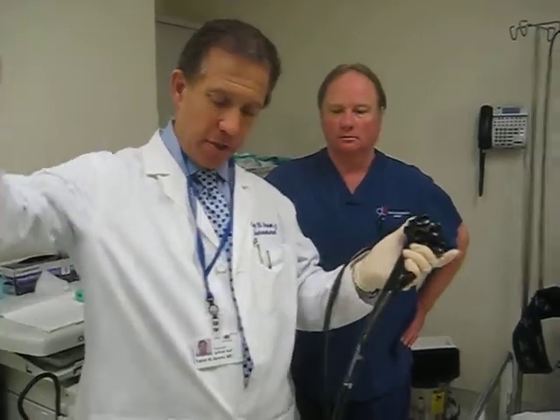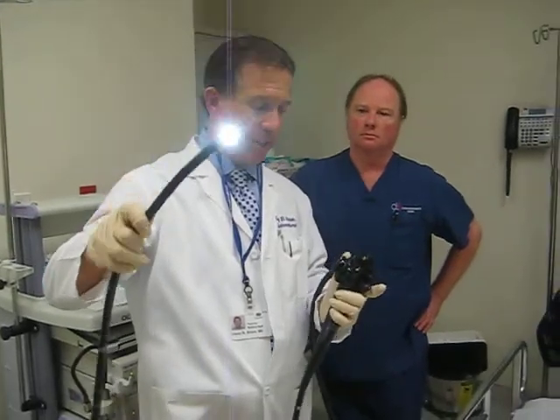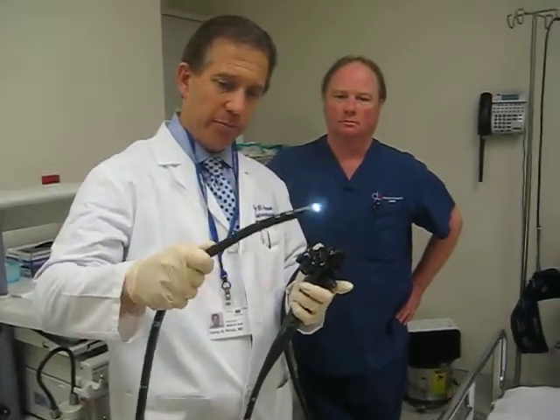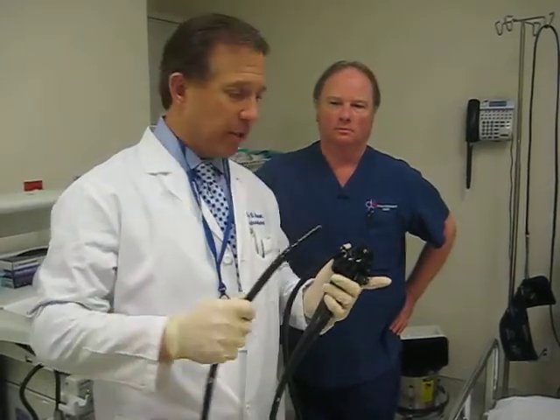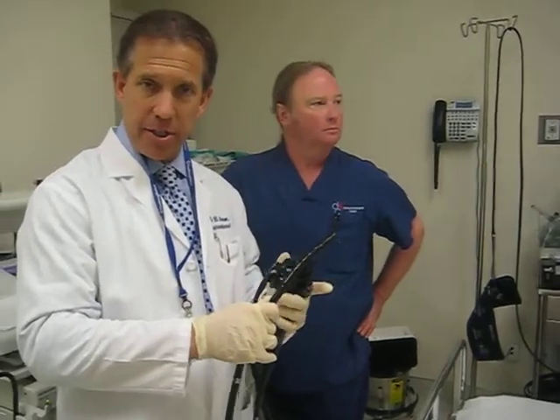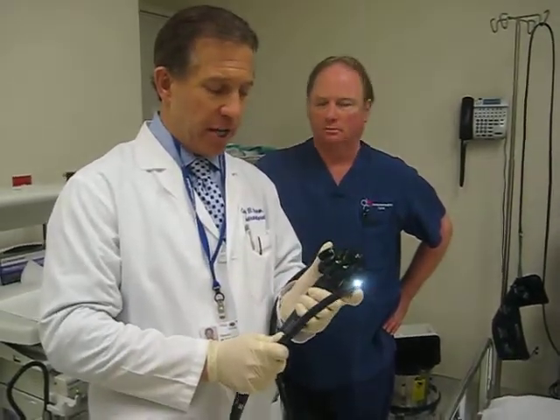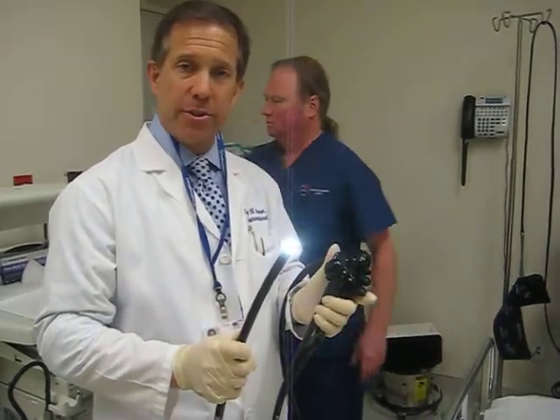So this is a colonoscope. It's long, it's flexible, it's got the light on the end of it. This is what we put into the colon. The procedure takes about 10 minutes. You don't feel anything at all because you are sedated. I normally do this with my tech Bob and the anesthesiologist. It's very, very safe and can absolutely prevent colon cancer.